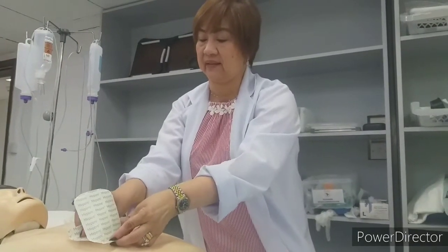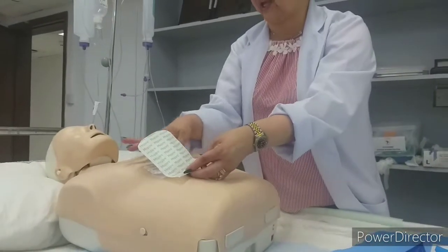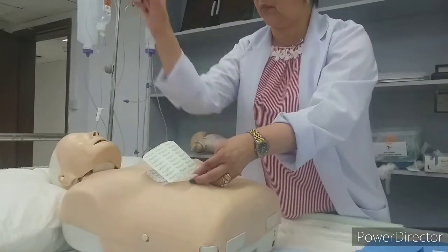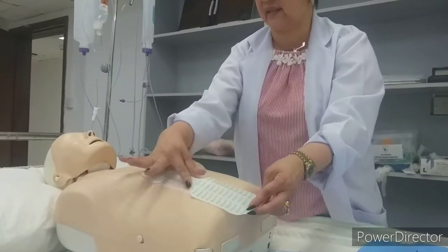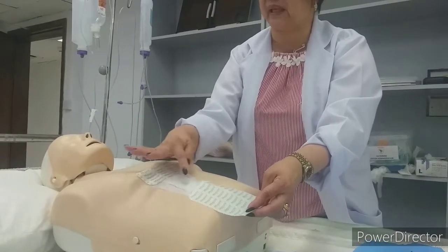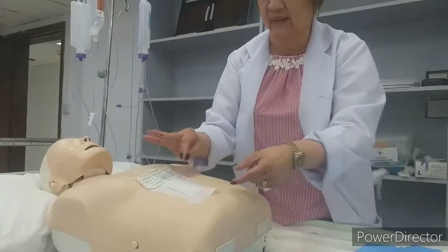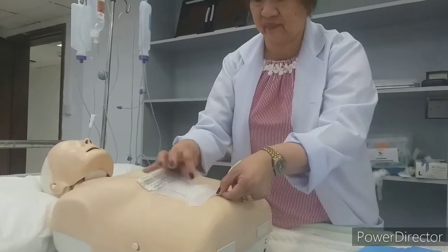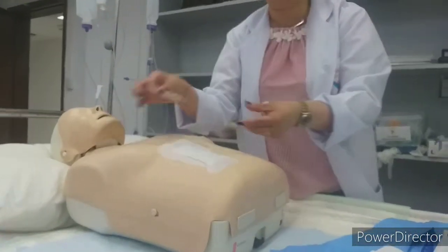Here, on your left, the shorter one, the longer one. So keep it. Apply a pressure here or just stick it. Two fingers slide down both sides. Do not touch in the middle. It might hurt your patient. So fix it. Take off.